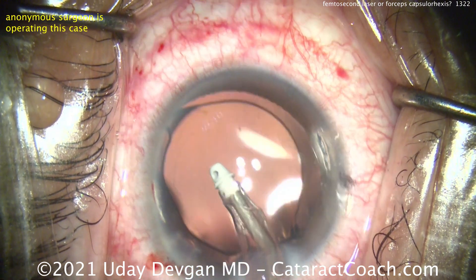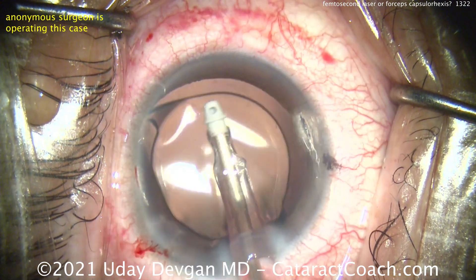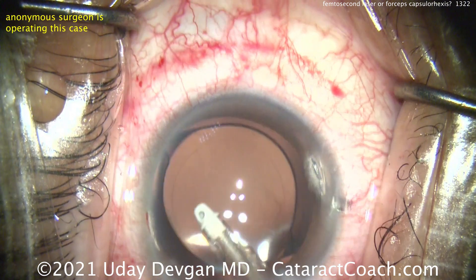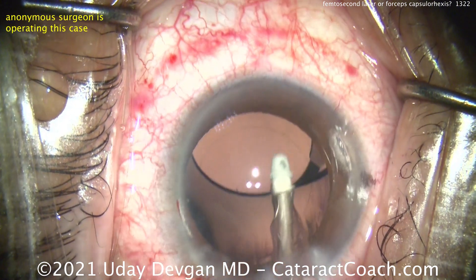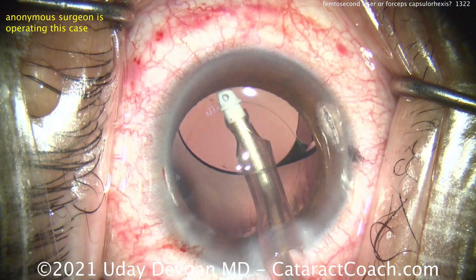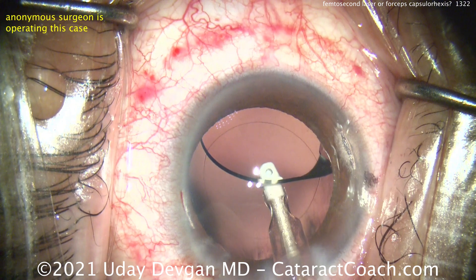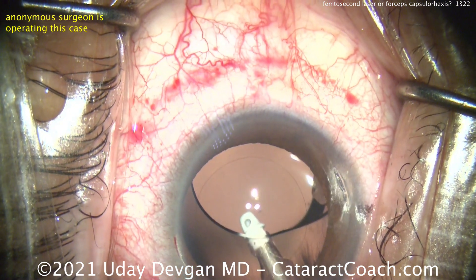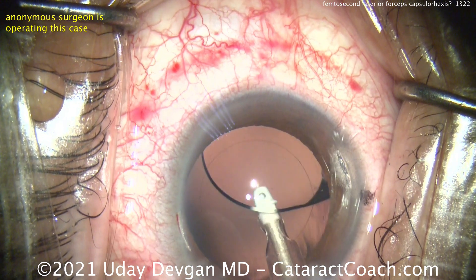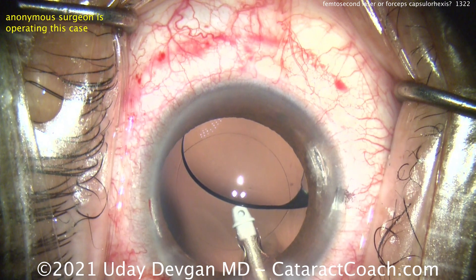Now, if you look at the conjunctiva — look at that ring of bleeding. That subconjunctival hemorrhage is very typical, and that's where you had the suction ring to couple the eye to the femtosecond laser. And look at the lens — the same exact lens, looks like a 6mm optic on an acrylic extended depth of focus lens. Getting that centered up, it looks nearly identical. Go back to the title slide and compare — you tell me if there's a big difference.